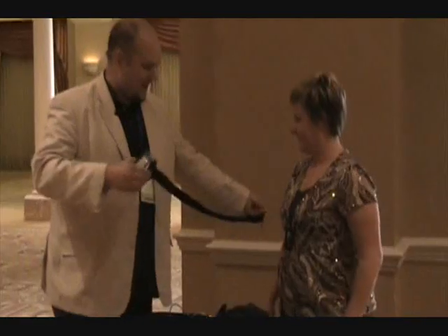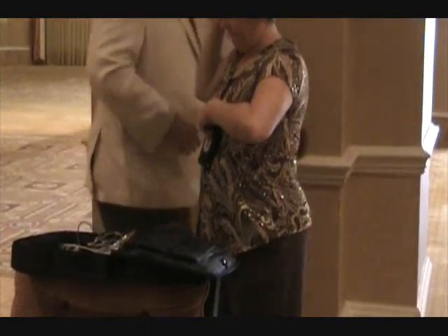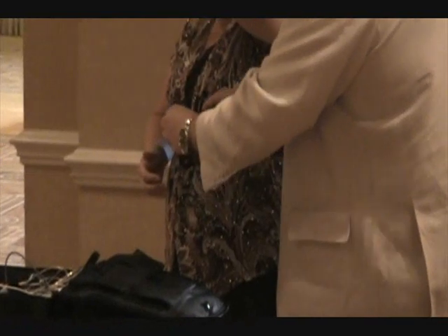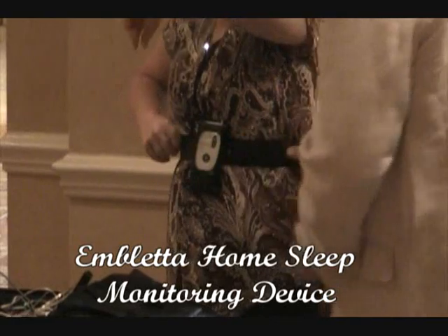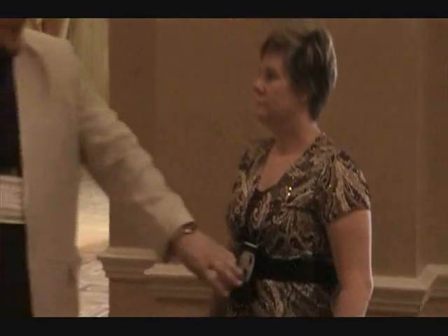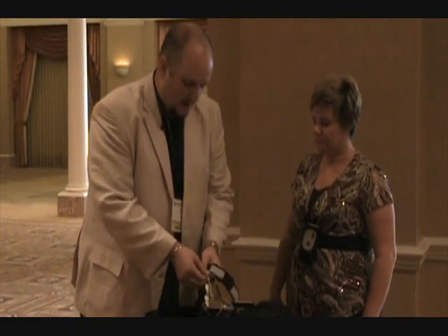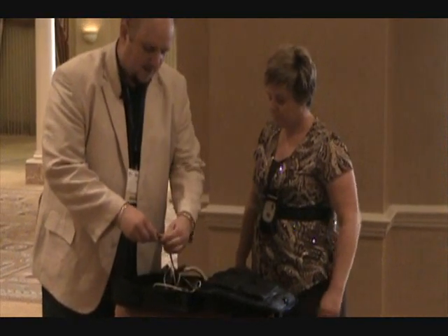The Embleta itself is going to strap to the center of your chest, right down here. You can hold onto it and we'll just pass the belt over and velcro it back onto itself. It should be comfortable and stay in place easily while you're standing up, but not so tight that it's constricting or hurting — just comfortably in place. I'll have you hook all these up so you can get a feel for how everything fits when you're home.